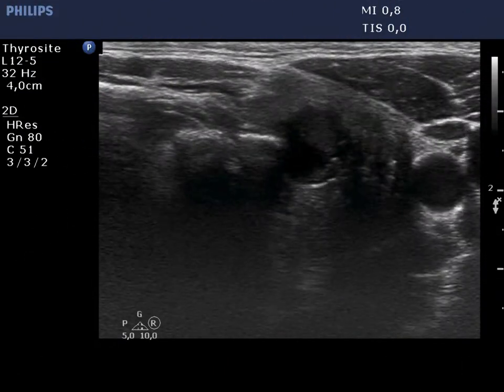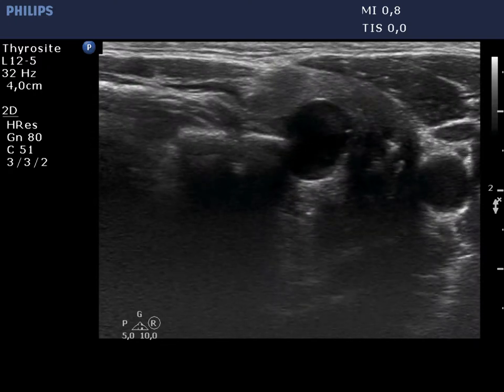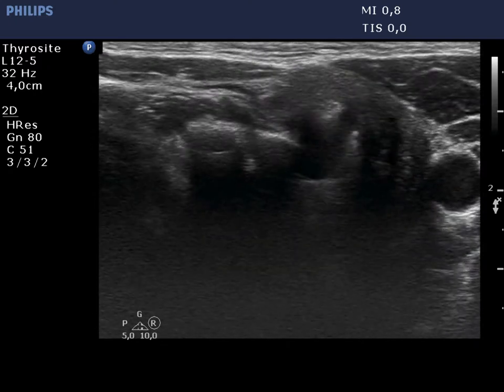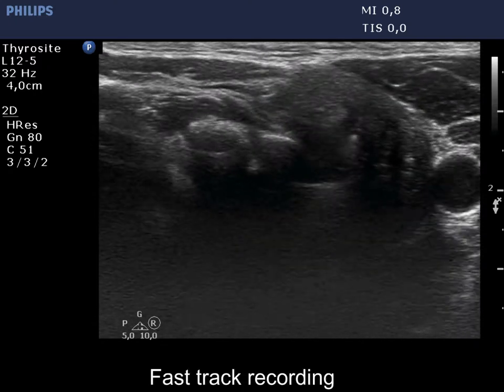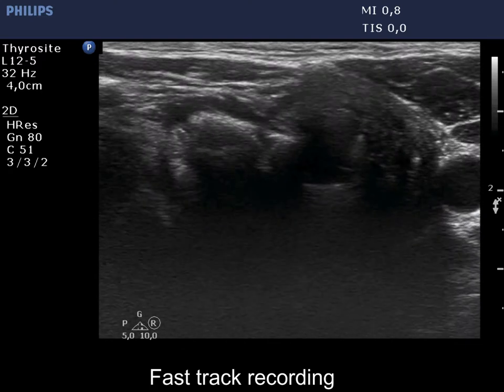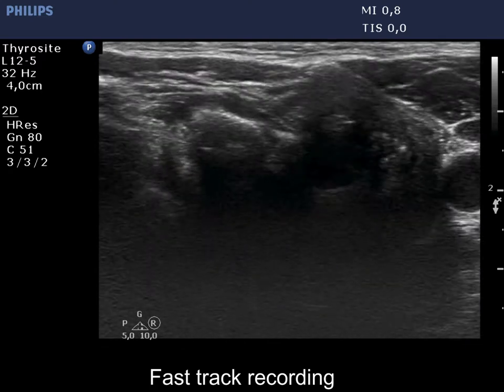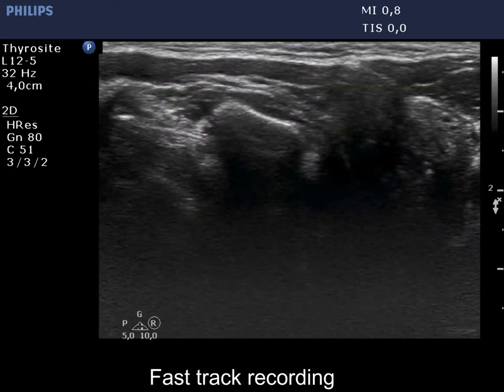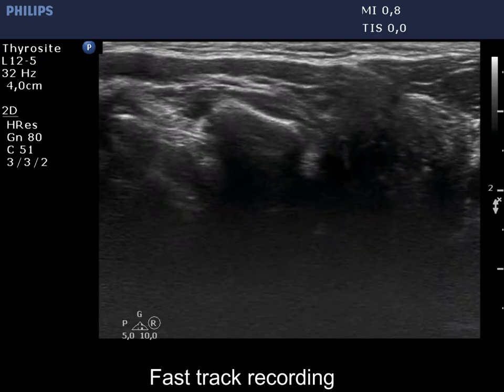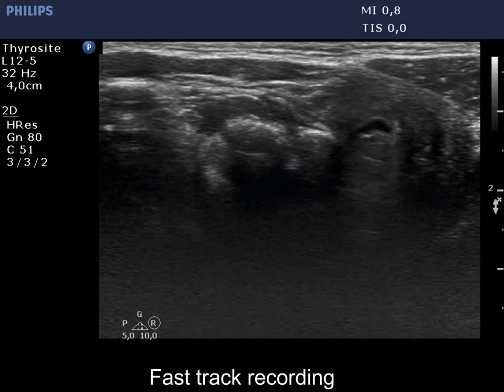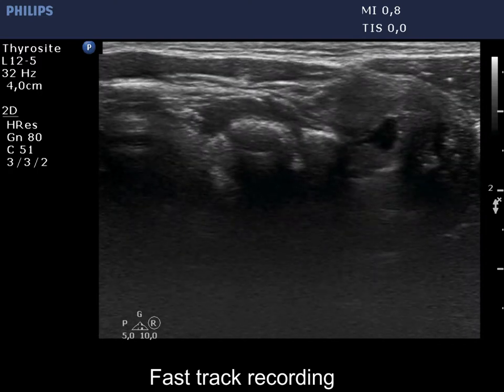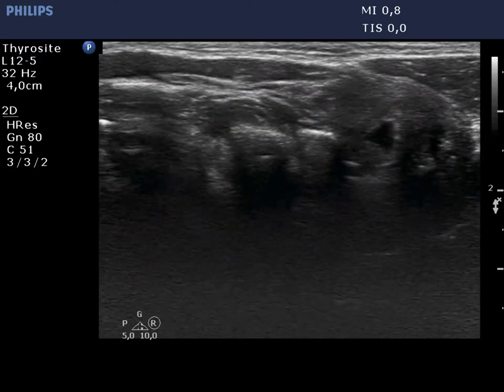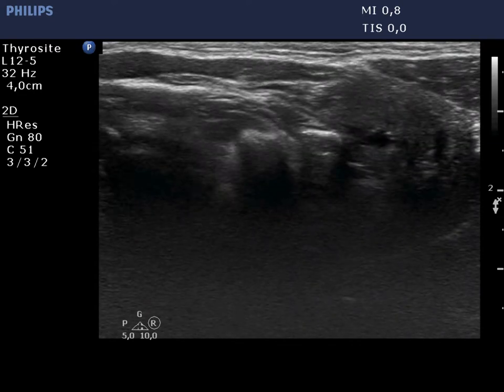The phase of alcohol administration: first we locate the needle in a safe position, and then start with the injection of ethanol. At advanced phases of sclerotherapy the nodules used to become rigid, as happened in this case. So I could eject only 0.5 milliliter ethanol.